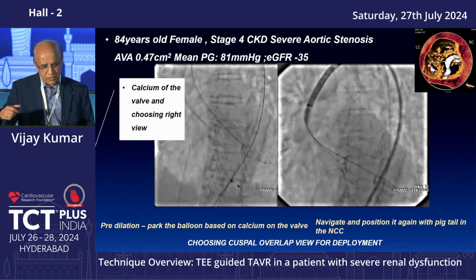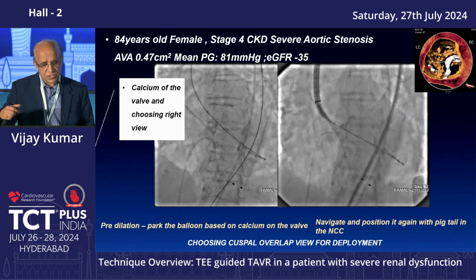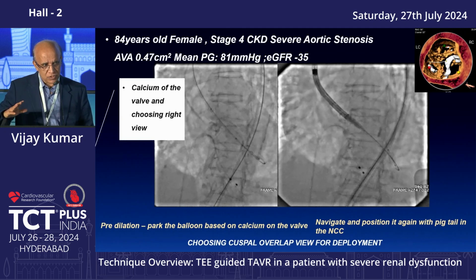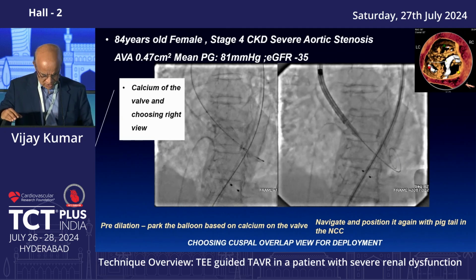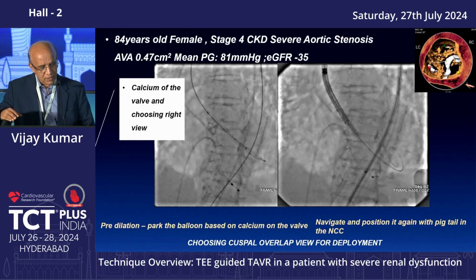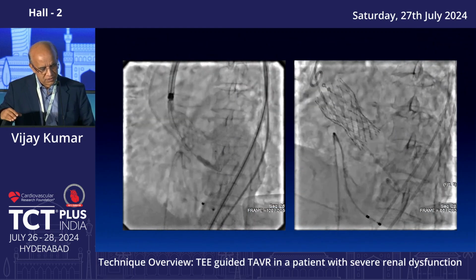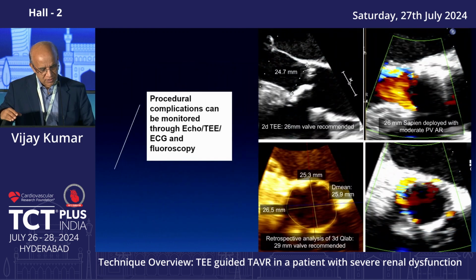That is the place where the role of the TEE multiplanar reconstructed image will help, so that you won't go for giving even a ml of contrast. So that's how we finally deployed the device, and this was zero contrast.